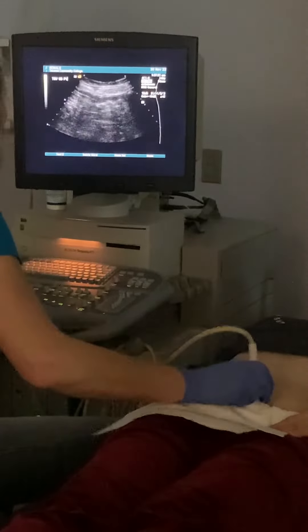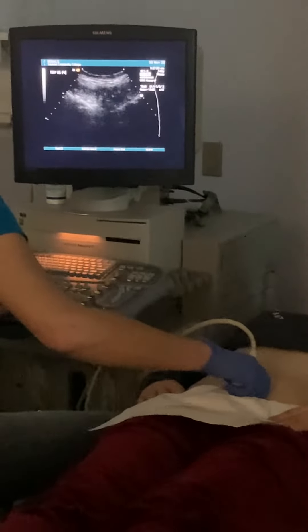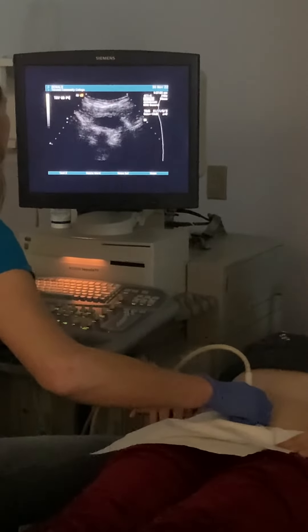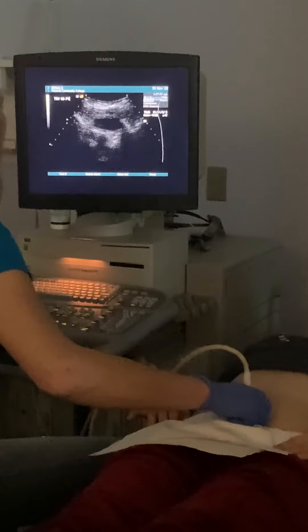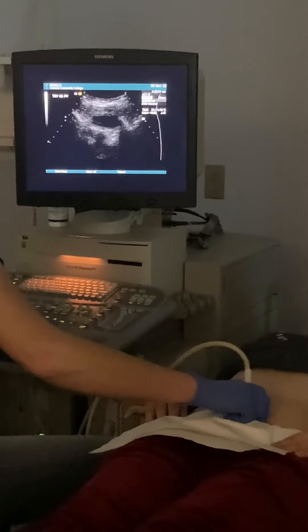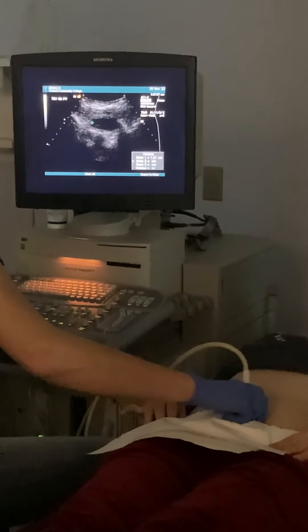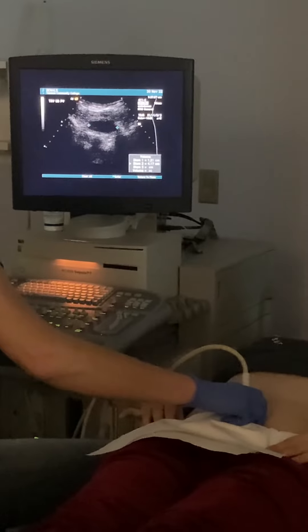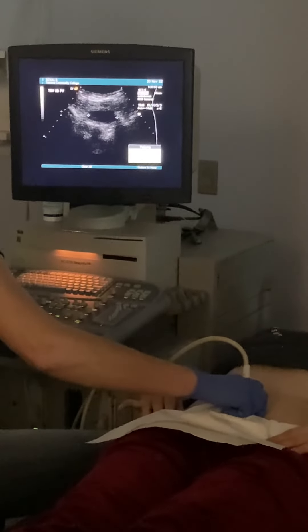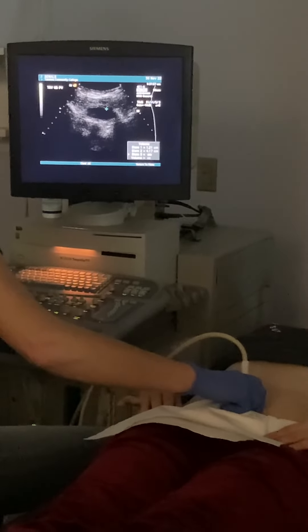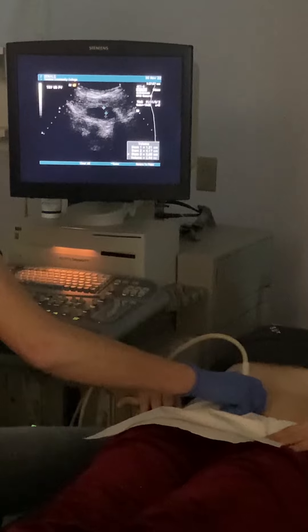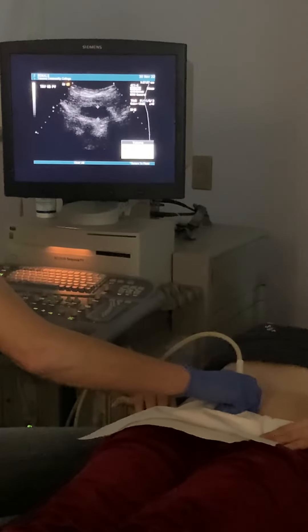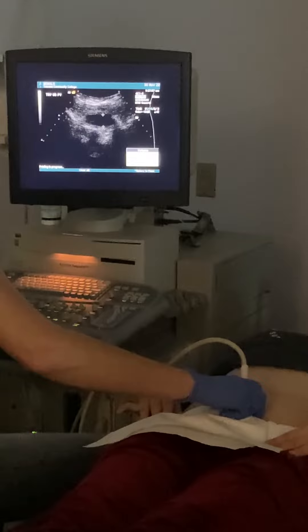And then we're going to switch to transverse. It's a little teeny tiny guy. Bring up our diameter two — this one's a little bit easier to measure than we had last time. And then diameter three is going to be our eight. So we went from a hundred and something to 4.7.